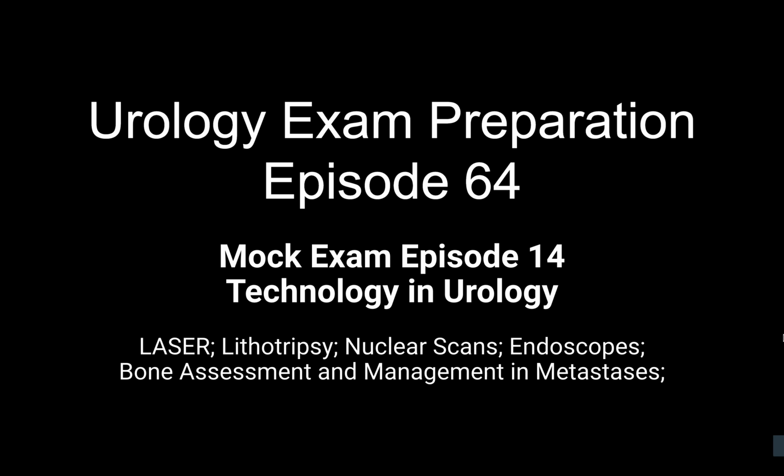DMSA scan is better for split function because it gives a clearer picture compared to MAG3. What do you mean by clearer picture? Because it is a static image. When a picture is taken, it shows the state of renal tubules better than MAG3.